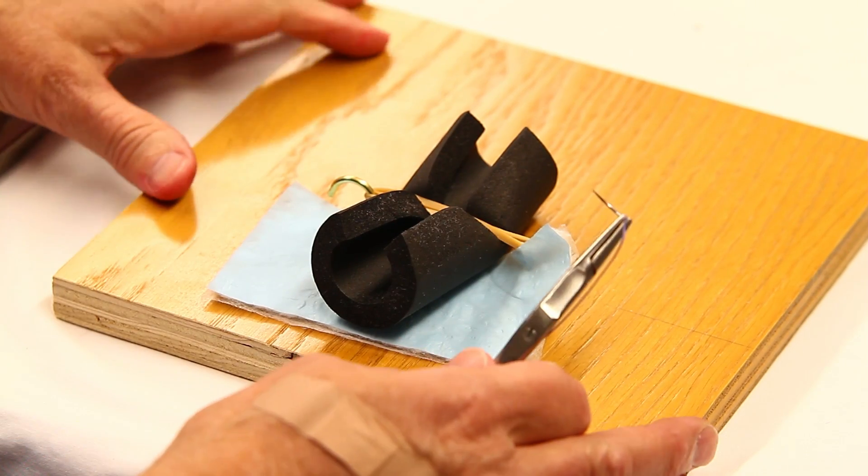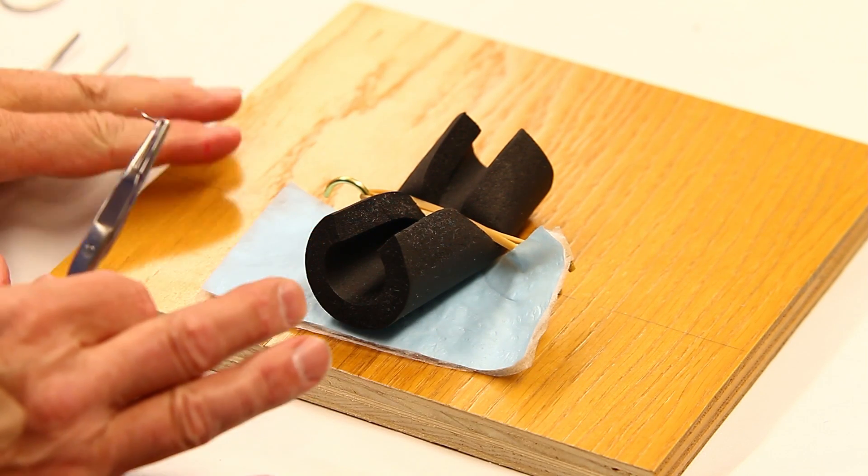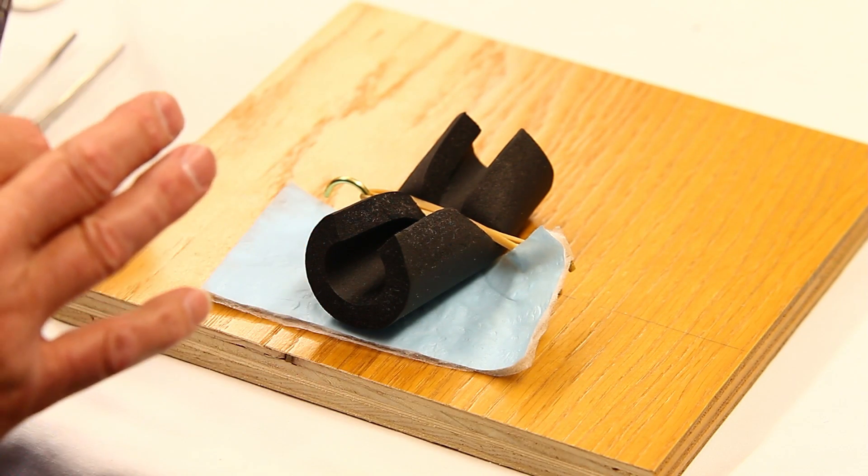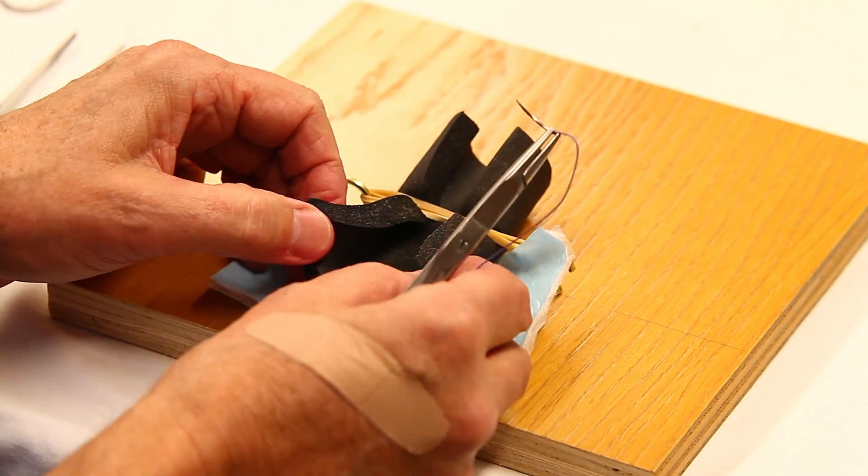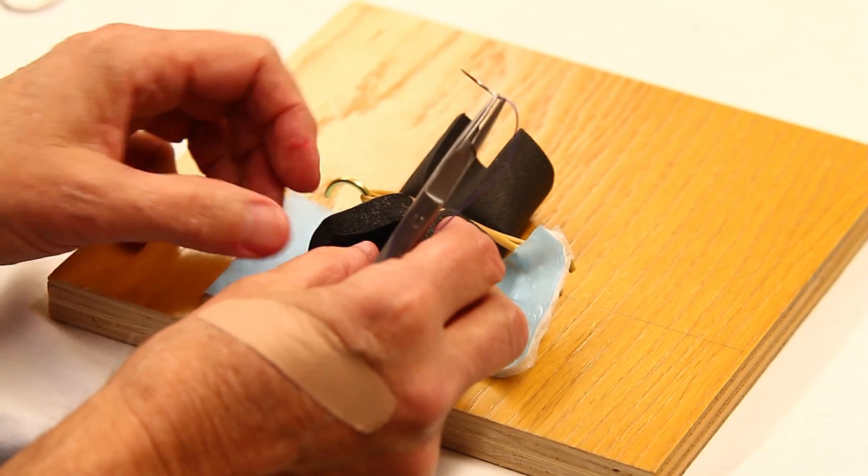In this part of the simulation, we're going to do some delicate suturing. This simulator is a foam insulator from Menards for a one-inch pipe.